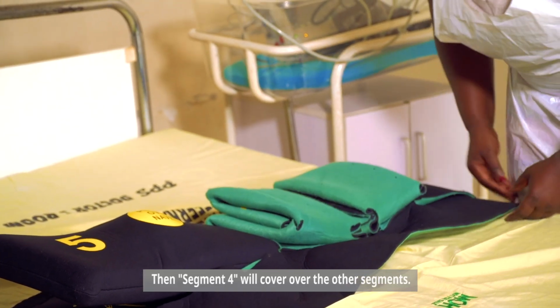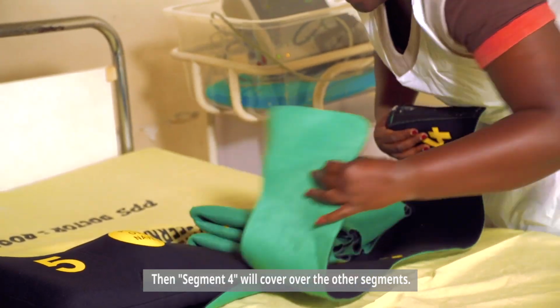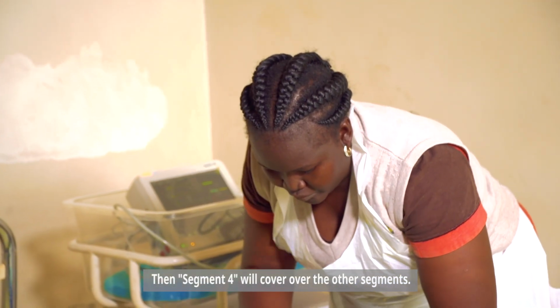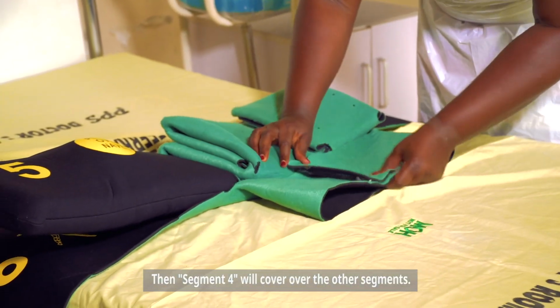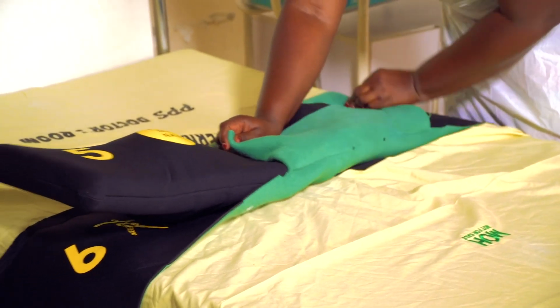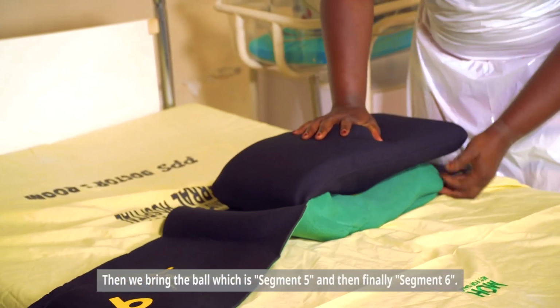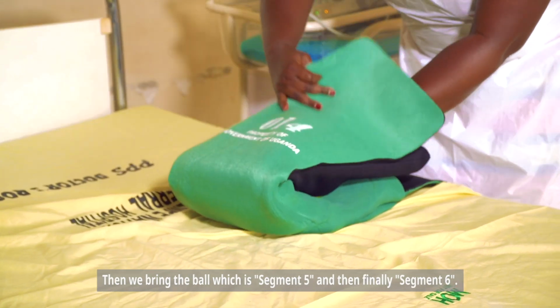Then 4 will cover. We fold segment 4, then it will cover over the other segments. Okay. Then we'll bring the ball, which is segment 5, and then finally segment 6.